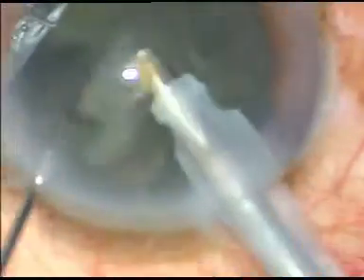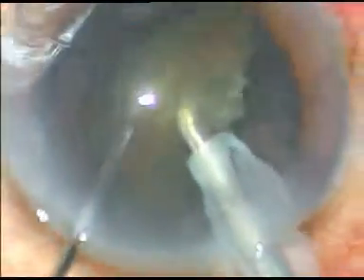This is direct chop. The phaco settings are: phaco power 45, flow rate 40, vacuum 170. The machine in use is the APASAMIS Galaxy CV1.